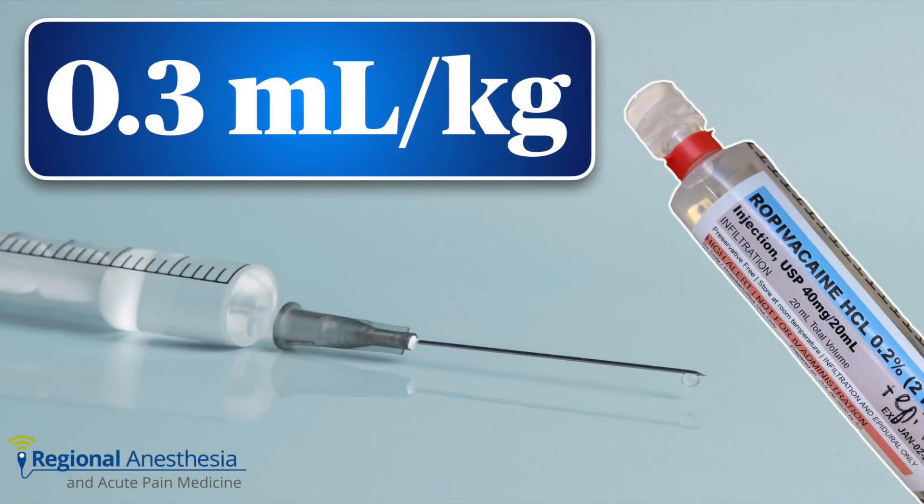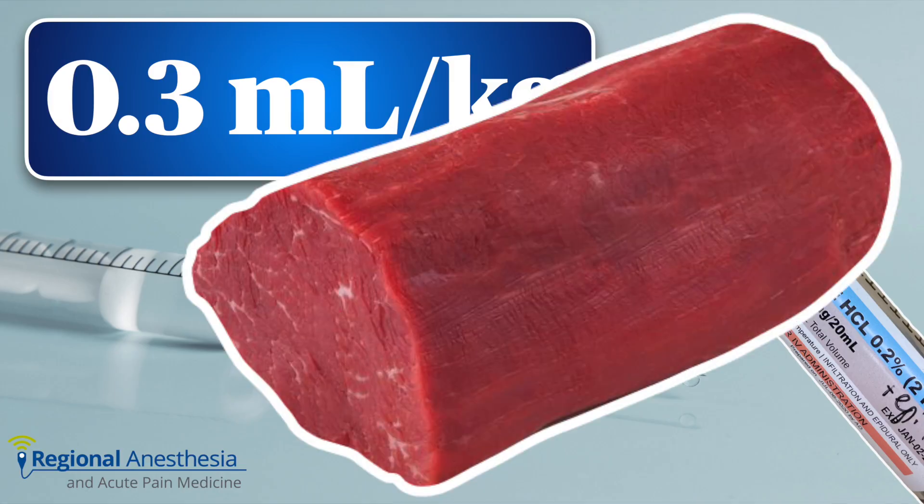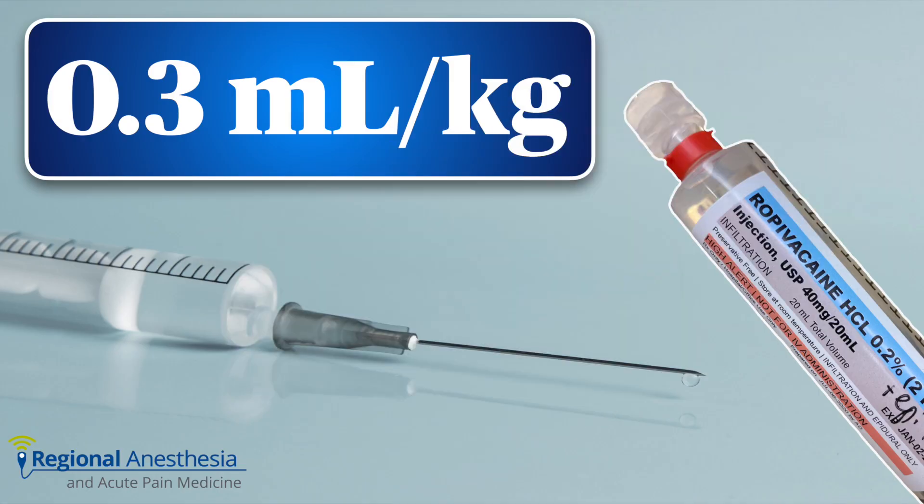Lumbar plexus block is a compartment block and you'll need to fill up that space. We usually use 0.3 mls per kilo, which amounts to about 20 to 25 mls in most adults. The psoas muscle is richly vascularized, so we'll always use epinephrine to vasoconstrict and keep our concentration as low as possible. We use 0.2% ropivacaine for analgesia and 0.375 to 0.5% for surgical anesthesia.